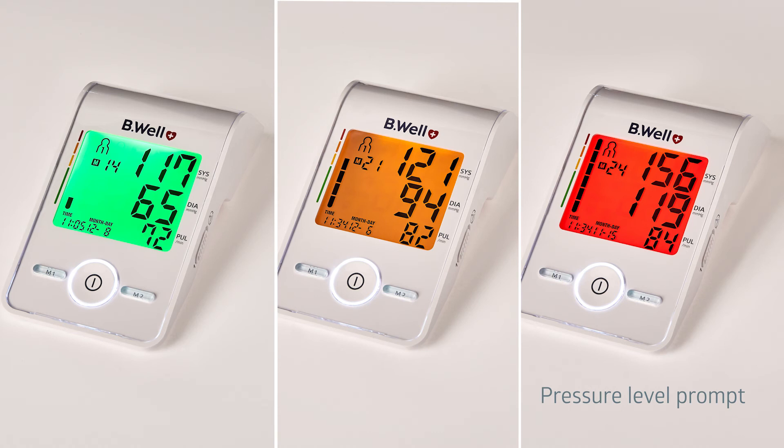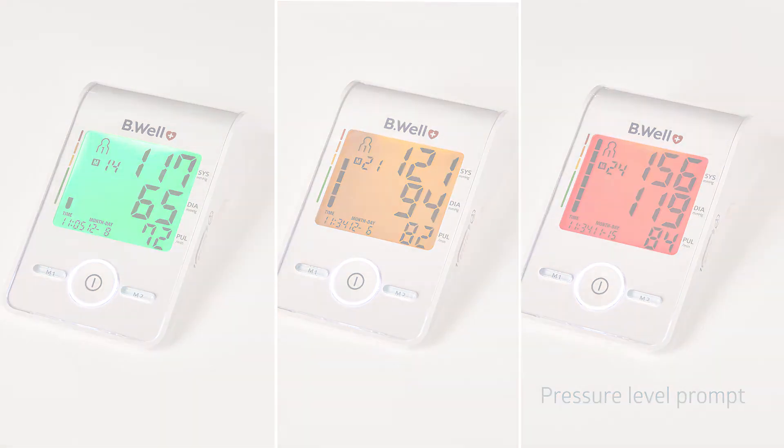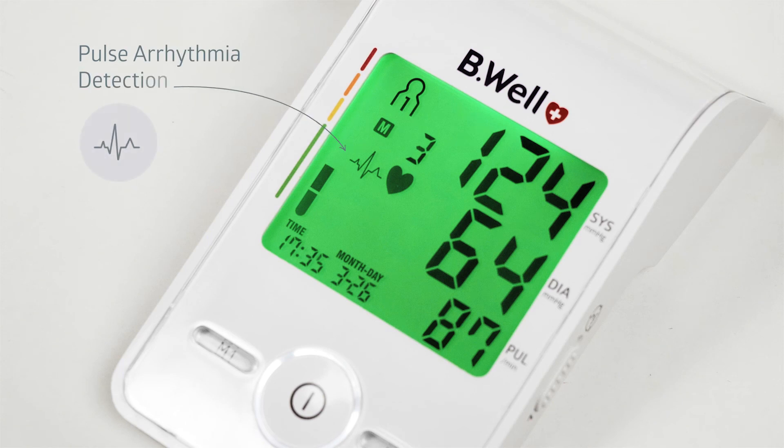Green indicates normal blood pressure. Yellow indicates borderline pressure. Red indicates dangerously high blood pressure. If the blood pressure monitor detects an irregular pulse during measurements, the arrhythmia sign will be displayed.